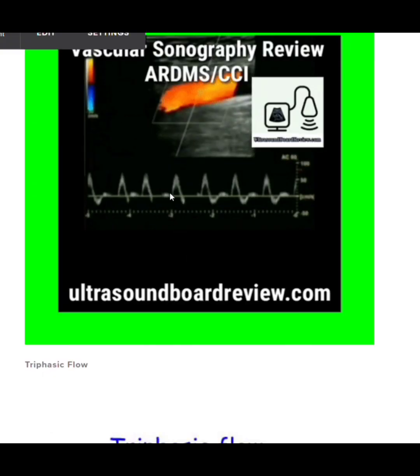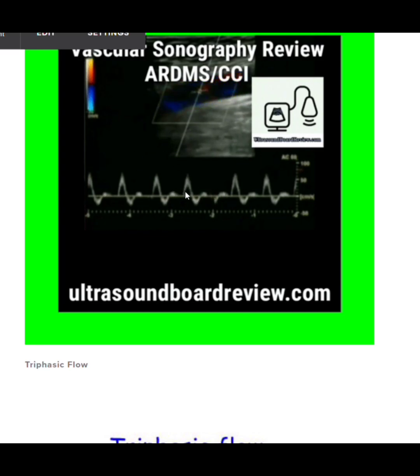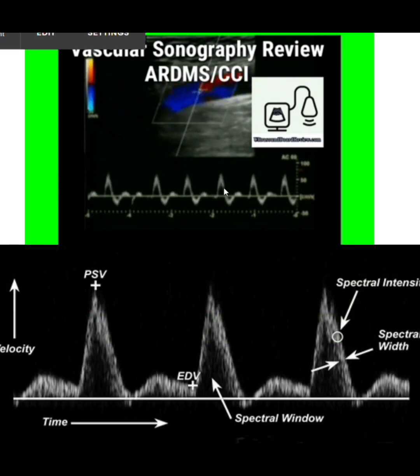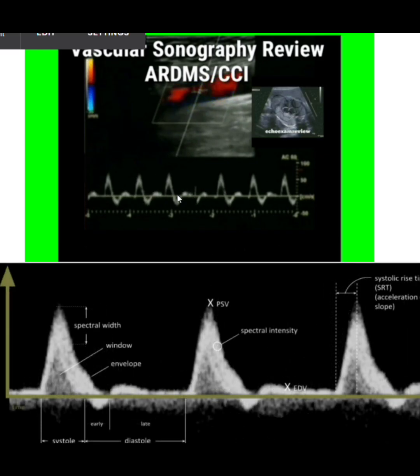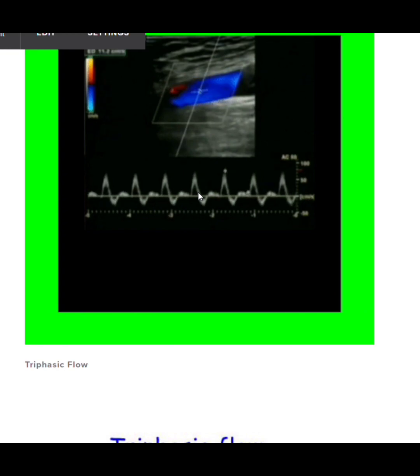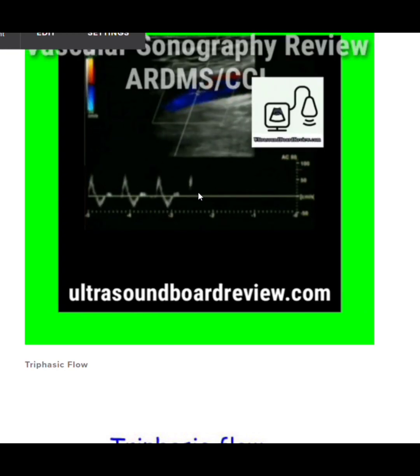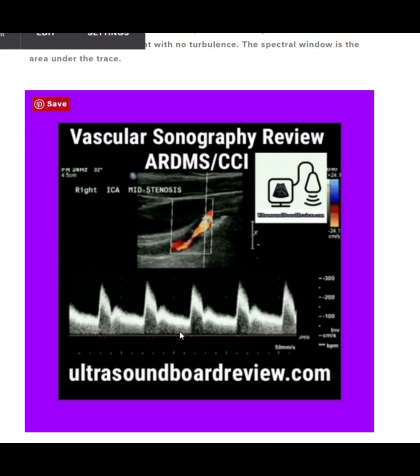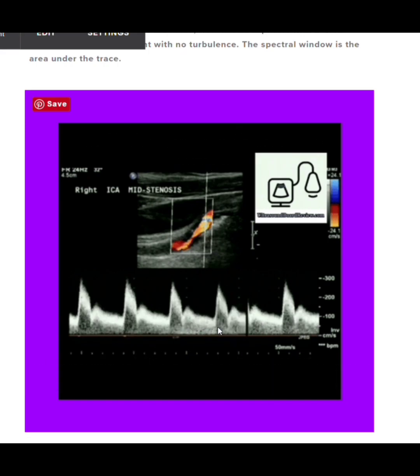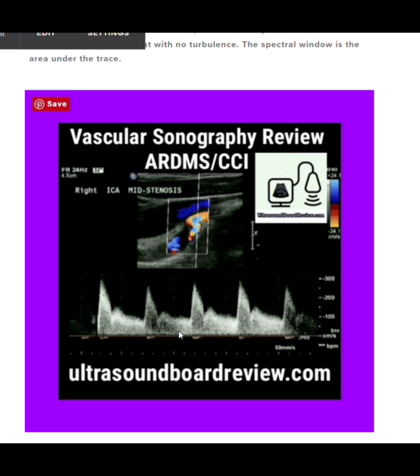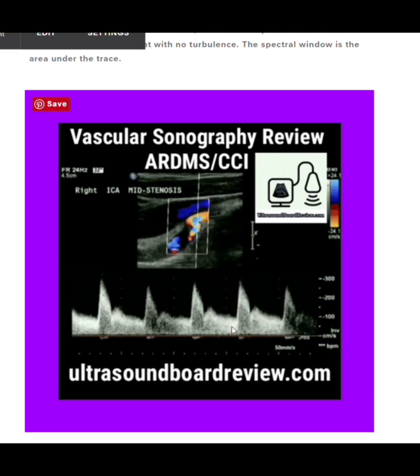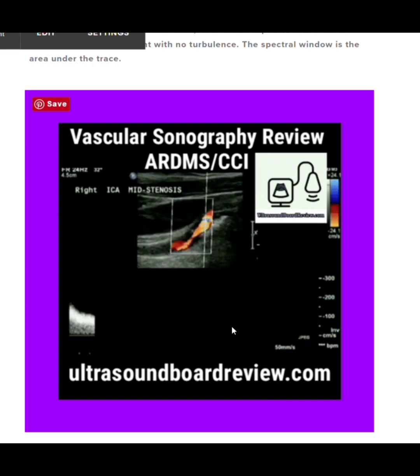Inside every normal spectral Doppler waveform there will be an anechoic area called the spectral window. If this is ever filled in, it could be due to a sonographer's error or some sort of disease. This is called spectral broadening. If you see spectral broadening that's not due to a sonographer's error, it's likely due to disease or a tortuous vessel.